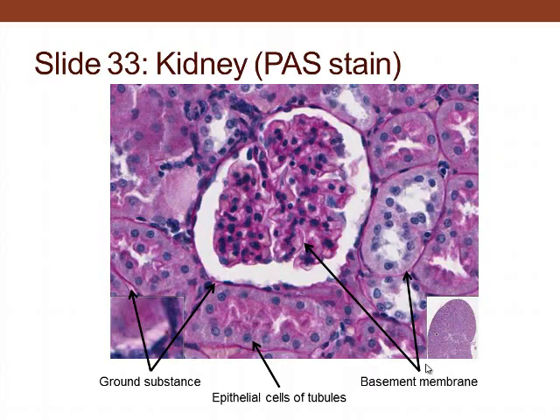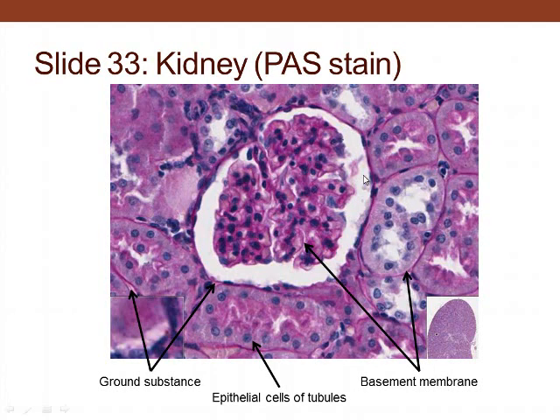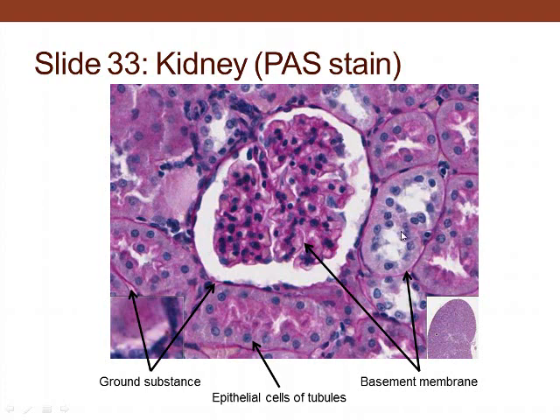Next we revisit the kidney. Previously we looked at the basement membrane and glycocalyx of the brush border of the proximal tubule. Today we focus on extracellular matrix: fibroblasts support the tissue between structures, and collagen bundles provide support throughout the interstitium.